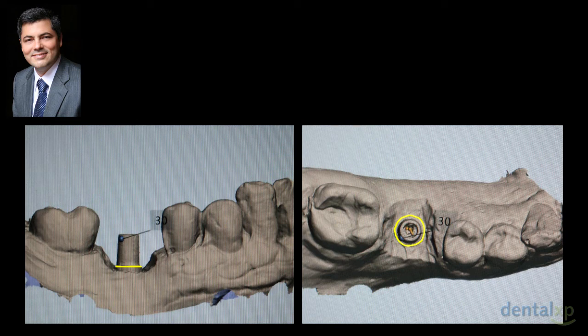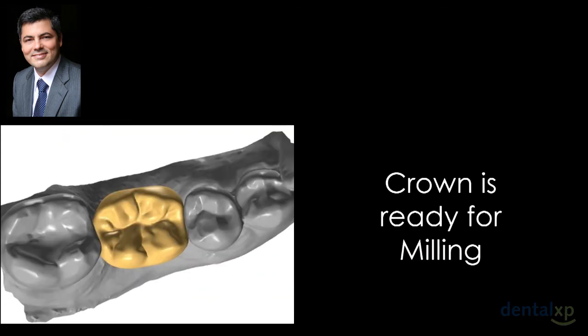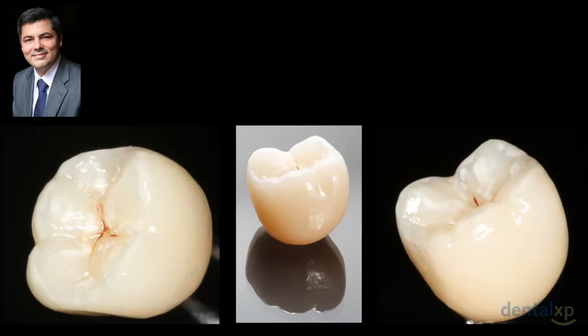So this is what was happening. This is where it comes from. So now that crowns go into the design software, you put together the anatomy, you put together the dimensions, you set your occlusion landmarks, and you're ready for milling.